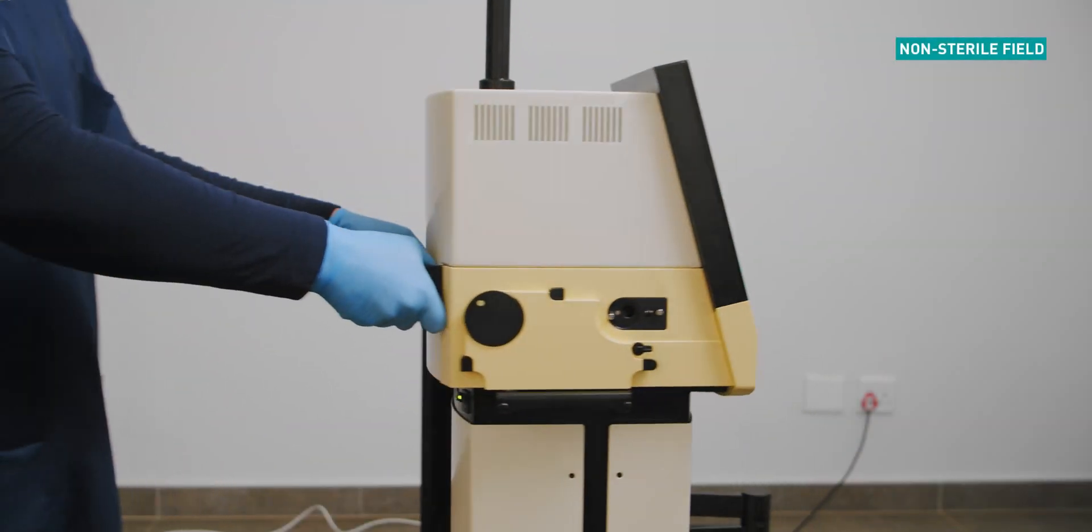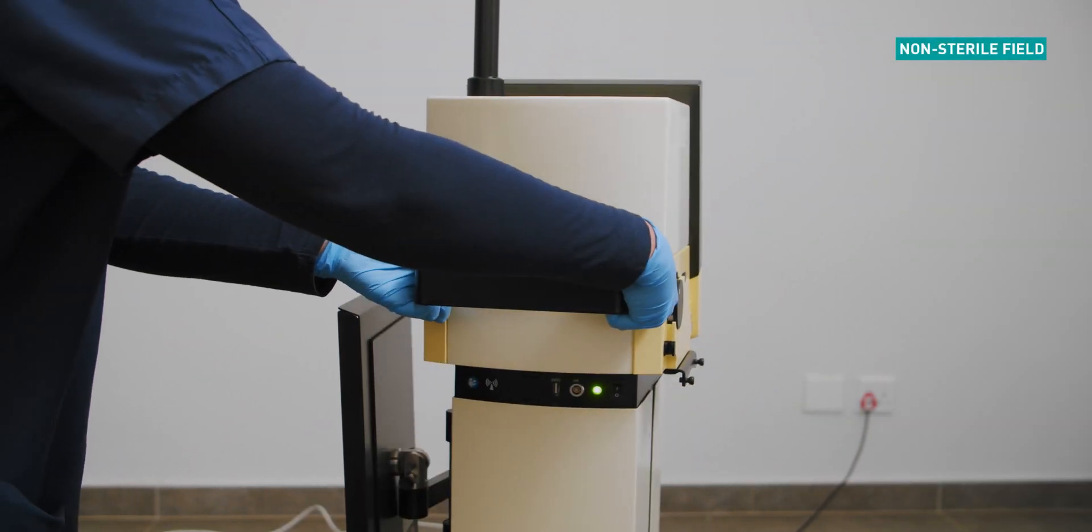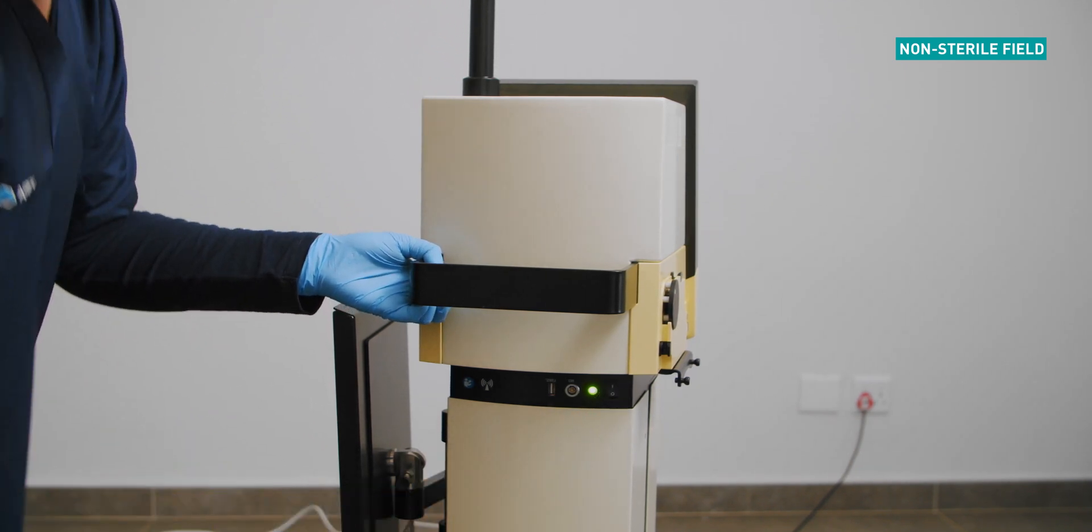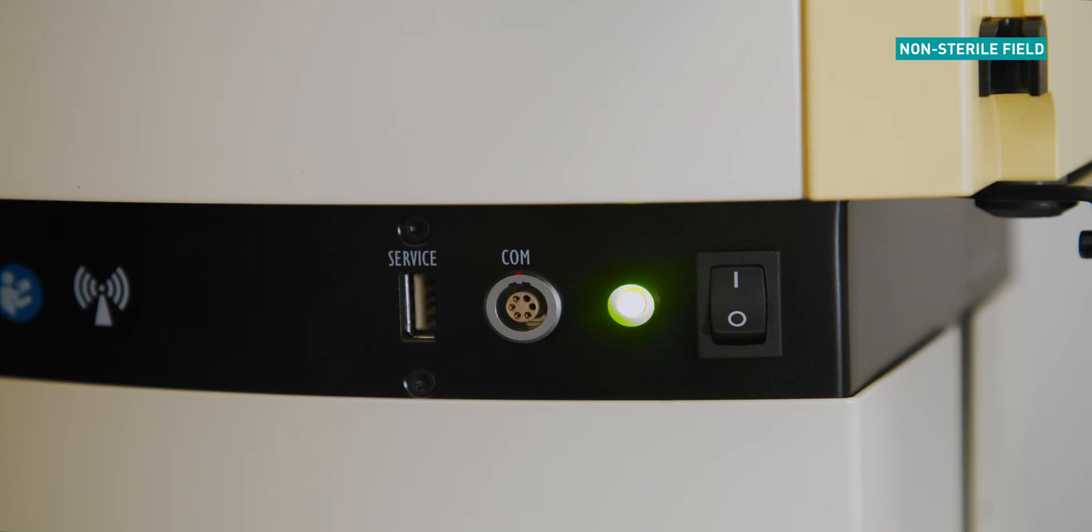To power on, select the power on button situated on the back of the machine. Make sure the LED indicator is green.